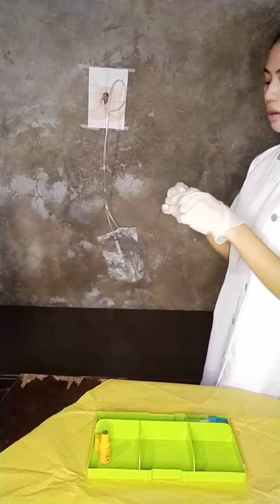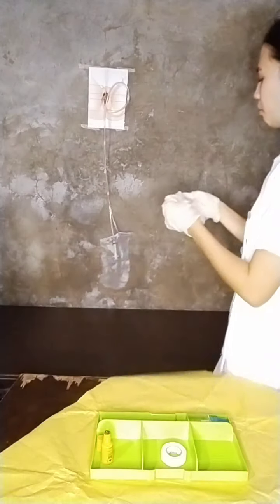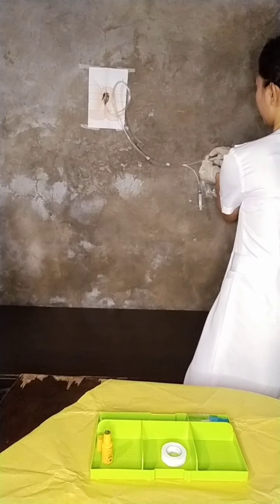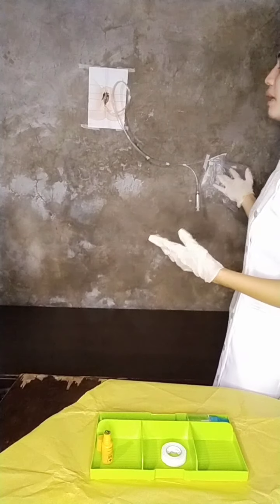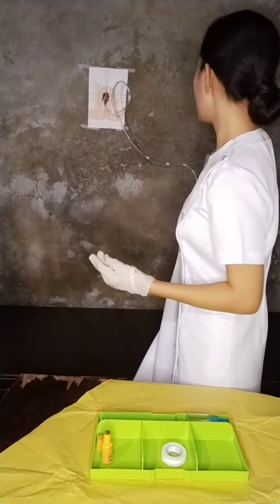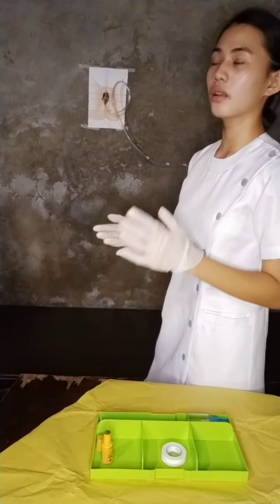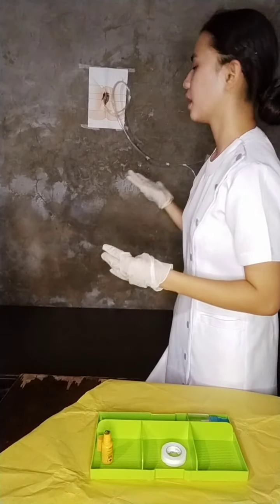And now you can proceed to securing the drainage bag to the side of the bed. It must be placed below the waist of the patient, because if the drainage bag is placed higher than the waist of the patient, it can cause backflow or infection to the patient.